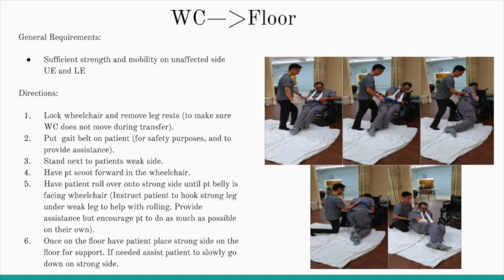From here, you can have the patient either lay on their back and start with exercises or stretches depending on the patient's needs. As far as the application of these transfers go, they can either be done to do exercises in supine, stretches. In some cases, they can also be done for stair training on patients who need to scoot their way up to the second floor in a seated position. And it can also be done due to a medical emergency. Sometimes, cardiac blood pressure issues, something like that.